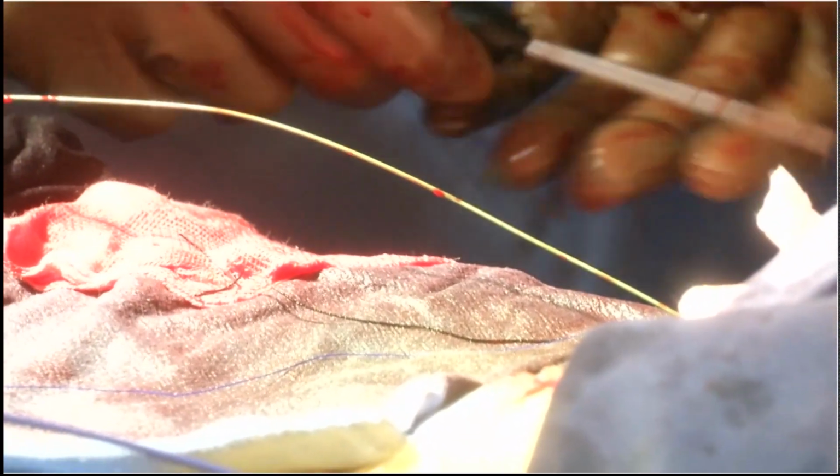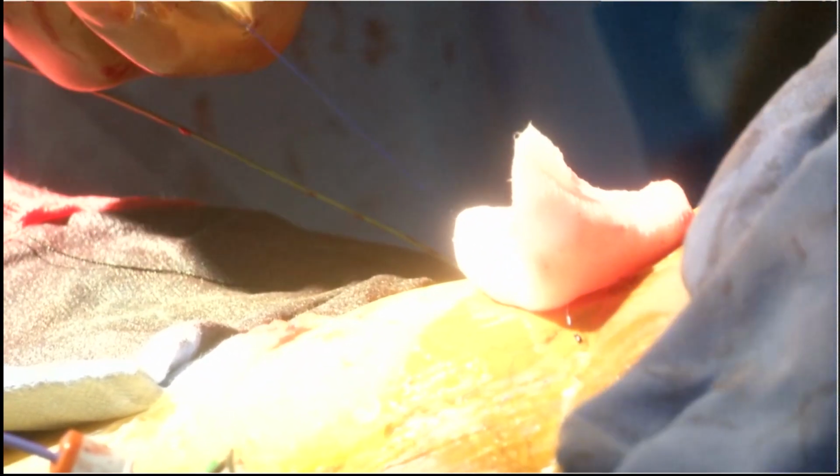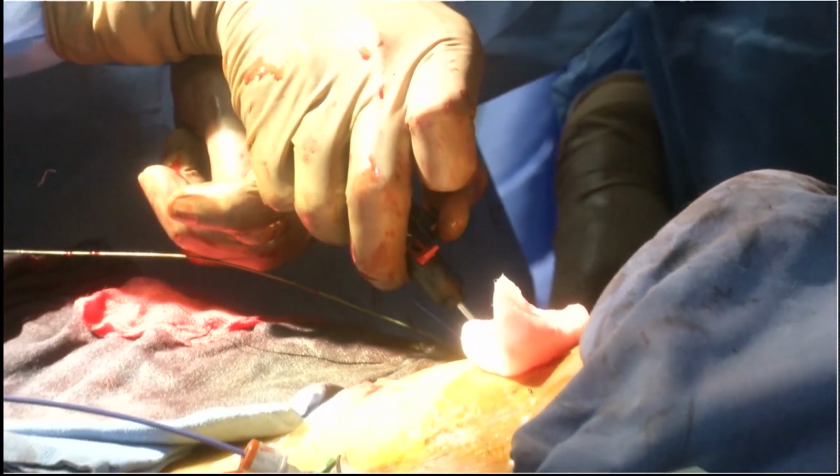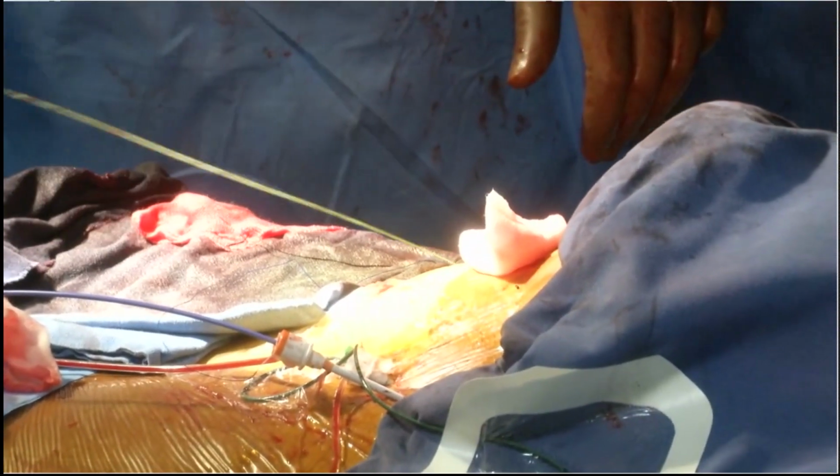So Thierry, what's your practice? Can you tell everybody your practice about closure of the femoral with two ProGlides on the wire? Yeah. So we use two ProGlides, provisional, when the femoral is small. We always close on the wire, the first and the second one. And then before removing the wire, there is no bleeding at all, after which we can remove it.